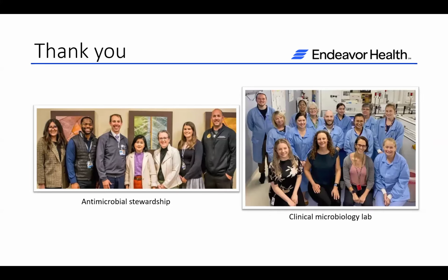You know, that's a really hard question. It's a really great question, but it's hard because you're right. Not all institutions are going to test the same antimicrobials, and they're not going to test them using the same method. Unfortunately, at a hospital you kind of get what you get, because we are all making these decisions on antimicrobial discs or panels, and there's limited real estate when we're choosing them.